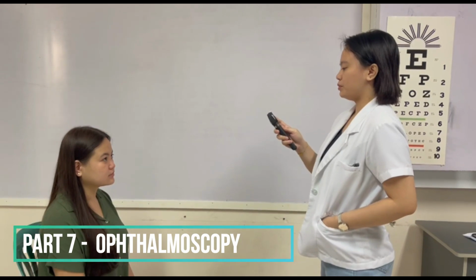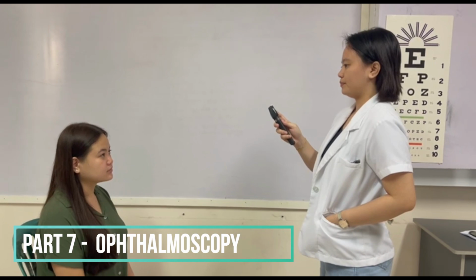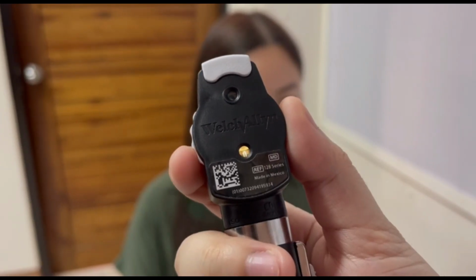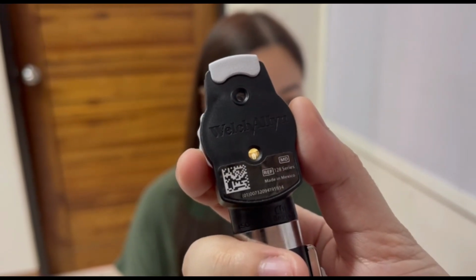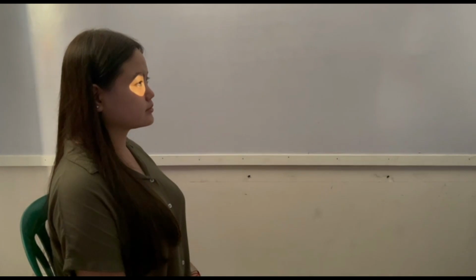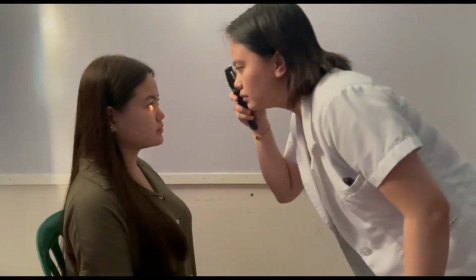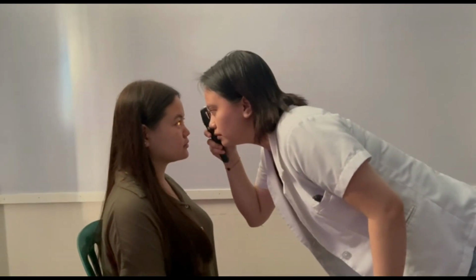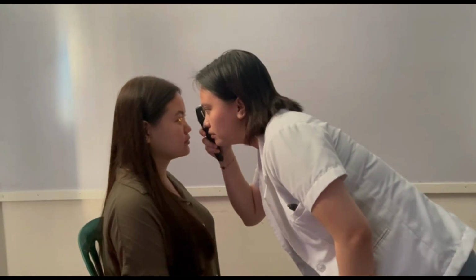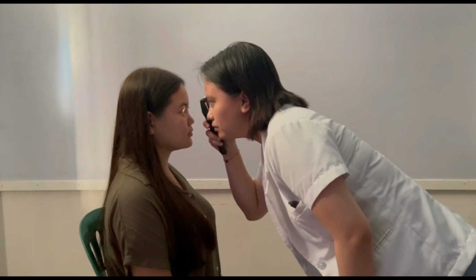Position the patient about 2 feet away and inform the patient on what you're about to do during the examination. Turn off the lights to dim and set the focusing lens of the ophthalmoscope to 0. Test the right eye first and check for the red reflex at a distance of around 2 feet. Approach the patient's eye. Steady the instrument against the patient's face by resting the ulnar border of the hand, holding the instrument against the patient's cheek.